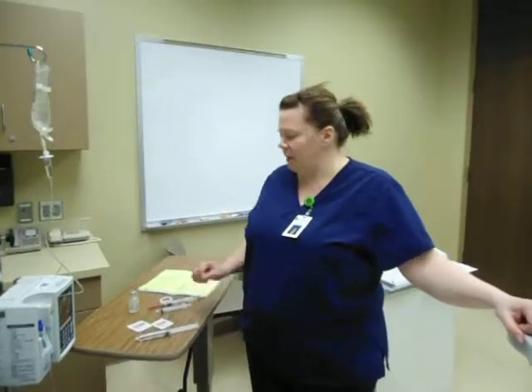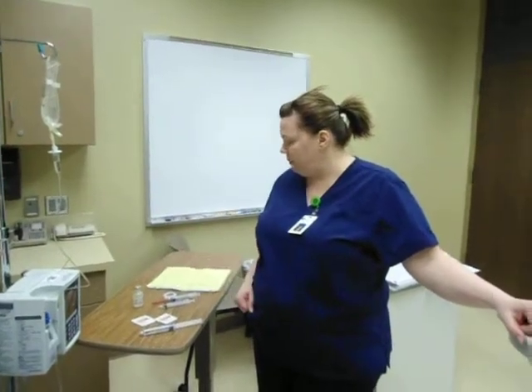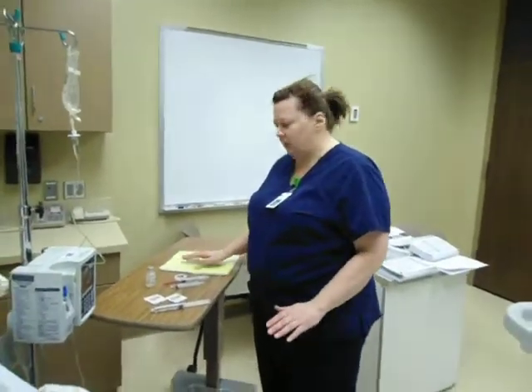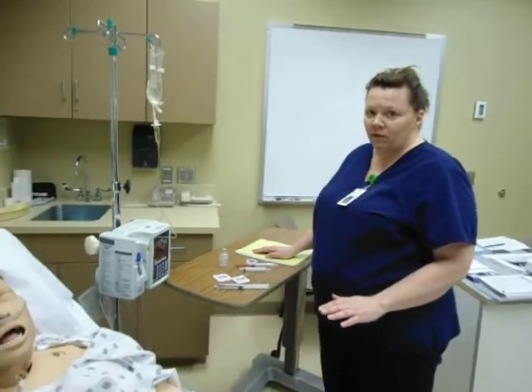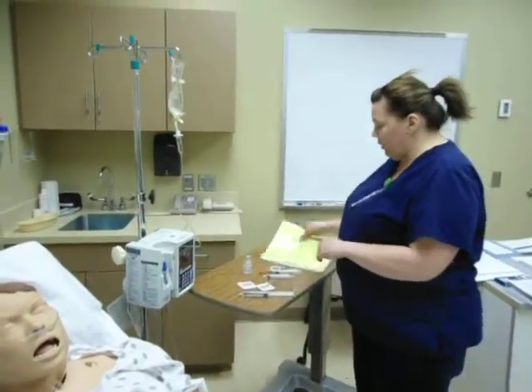Shelby Brayland. I'm going to be doing IV push with Verapamil. My physician orders here are for Verapamil, and I have an 82-year-old gentleman that I'm going to be doing it on. His name's Pat Smith, and I have gotten my orders.